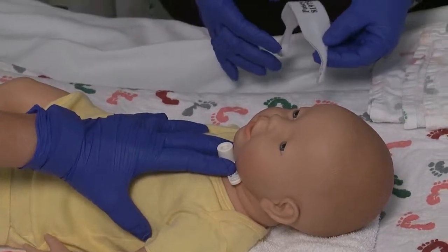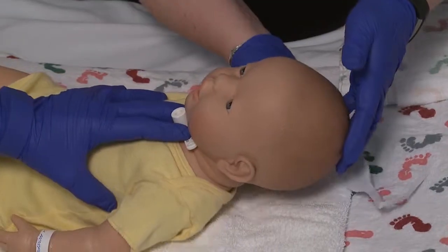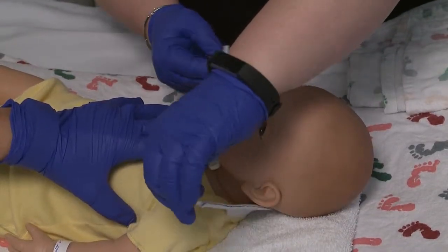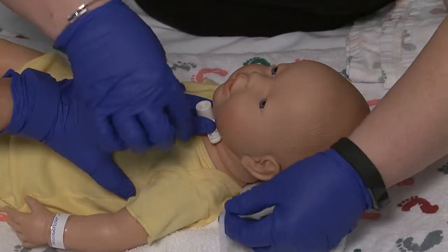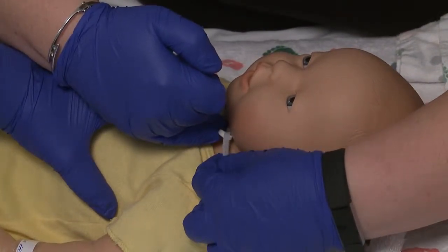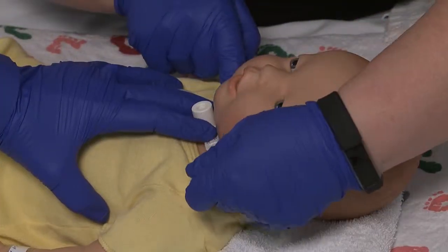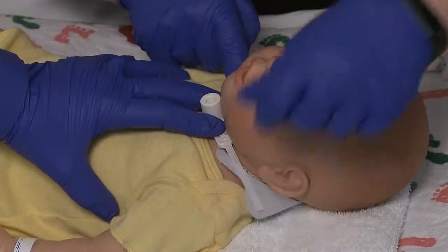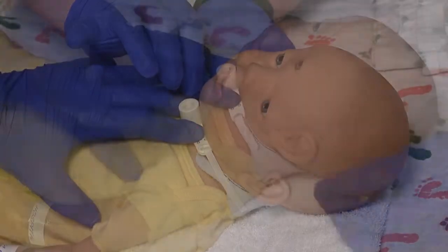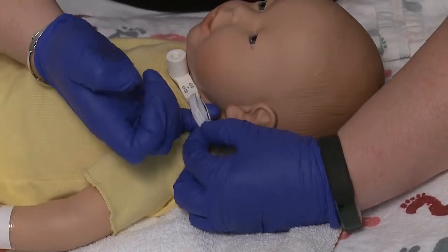Your new clean tracheostomy tie is the same — it has the same velcros that will hold it in place. Lifting your baby's head again, you would slide that under their neck and line those ties up to be evenly spaced. You would then take that velcro tie and feed it up through that eyelet on the trach flange, all the while having your trach secured by your second set of hands. Put that velcro down on the tie so it sticks and do the same process on the other side. Always make sure that you can slide your pinky finger underneath that trach tie to make sure it's not too tight.